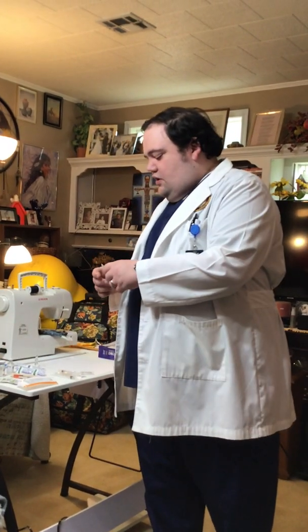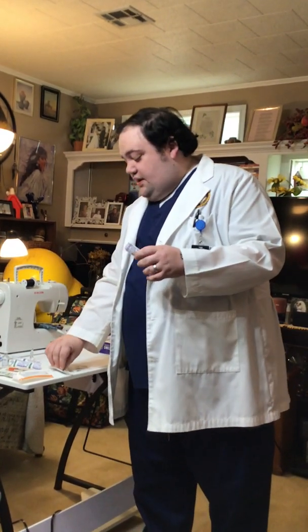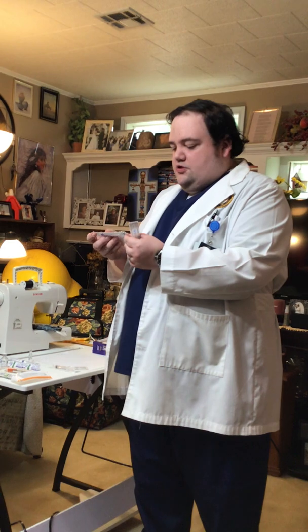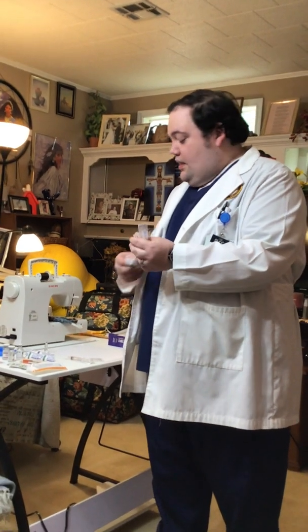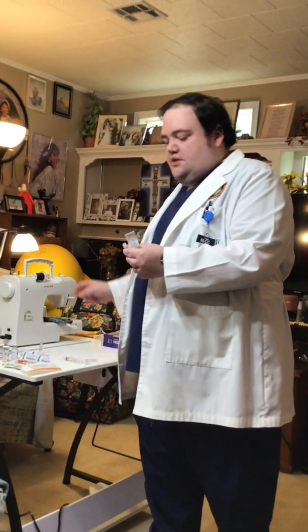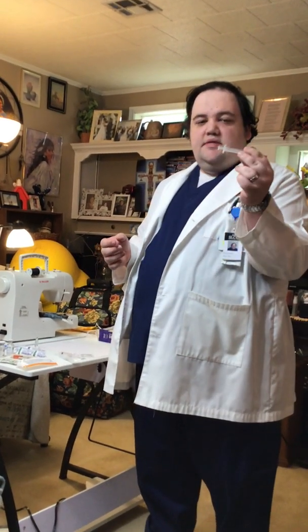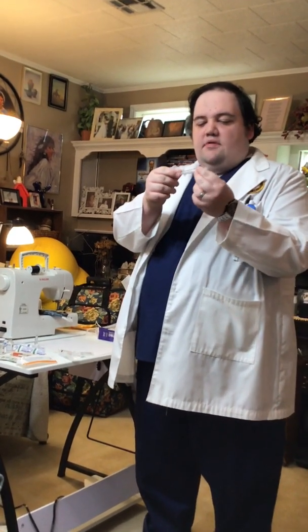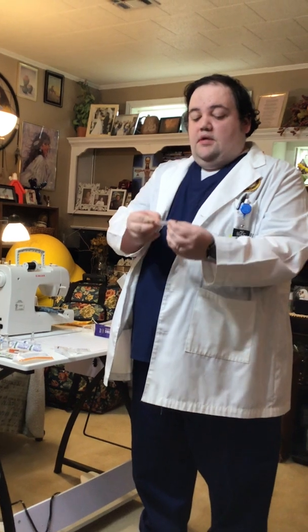Remember, all injections are given with sterile technique. All right, so that being said, I'm going to maintain the sterility of the supplies like so. We're going to take out our 3 cc syringe, or 3 milliliter syringe. I cannot touch the inside of the plunger. I can only touch the outside. If I touch the inside, then it becomes unsterile. And I kind of need to break it loose a little bit.